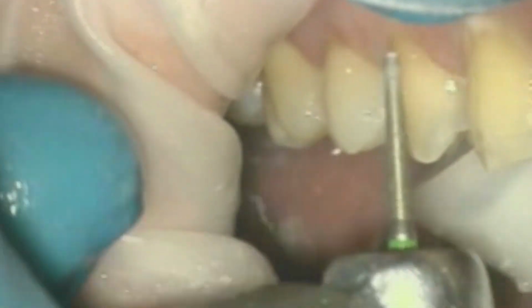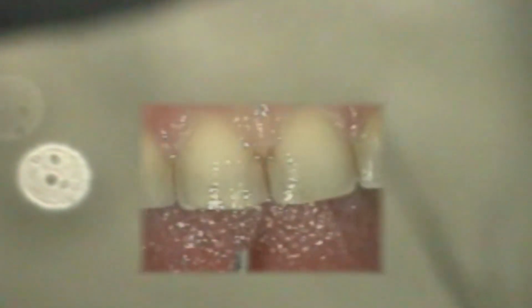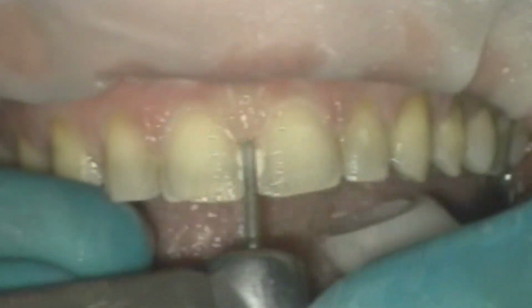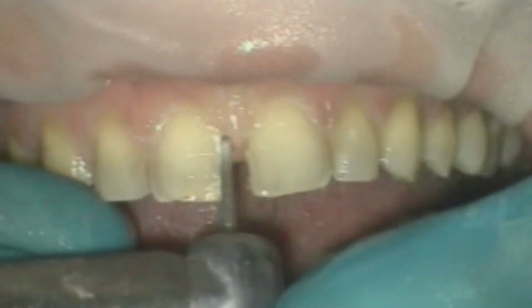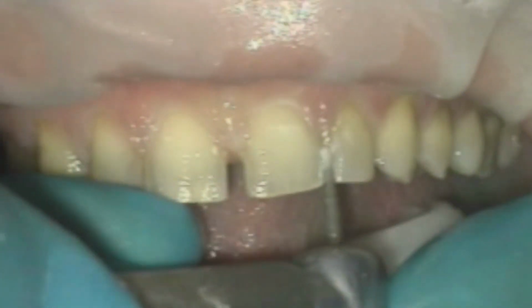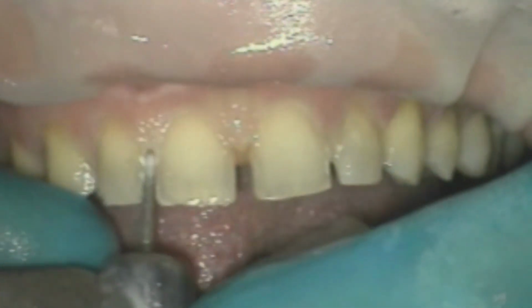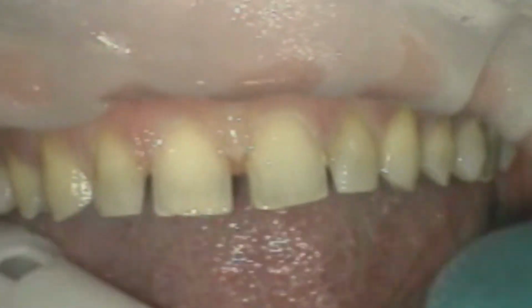But we know that utilizing a high speed HVE is going to help us with those large volumes of aerosols. An evacuator that pulls a high vacuum but does not remove a large volume of air, such as used routinely in hospital suction, is not considered an HVE. When we think about a saliva ejector, that is no comparison. The usual HVE used in dentistry has a large opening, around 8 millimeters or greater, and is attached to the evacuation system to remove a large volume of air, up to 100 cubic feet of air per minute. That's what we're looking for.